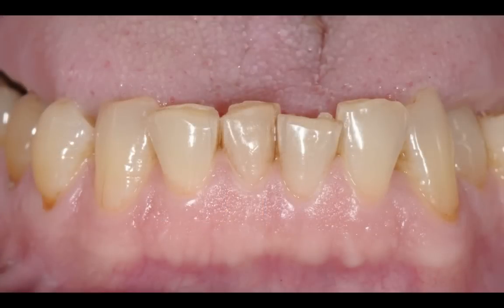So here's the case — I'll share with you the lower incisors since that's what we're talking about today, but we did complete a full mouth rehabilitation for this patient. I know those of you are thinking this is a good ortho case. The patient was in his late 50s and did not want to do ortho. It was totally off the cards.